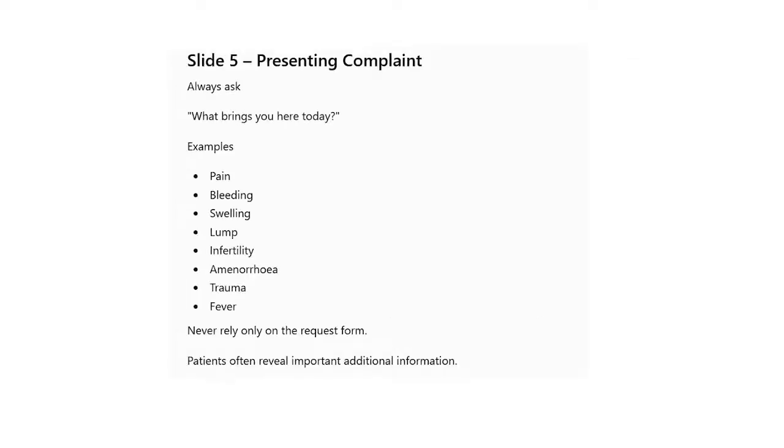Presenting complaint: always ask what brings you here today. Examples: pain, bleeding, swelling, lump, infertility, amenorrhea, trauma, fever. Never rely on the request form. Never, never, never. Patients often reveal important additional information when you're doing the scan.